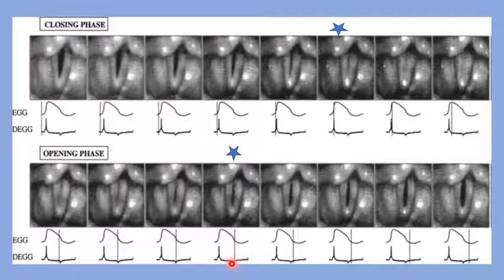of the vocal folds to peel apart, opening up the glottis in this frame in here. And then progressively the opening phase would continue, opening up the glottis further until the open phase is achieved here. You could see open glottis, and we are in this area of the glottal area waveform and its time derivative.